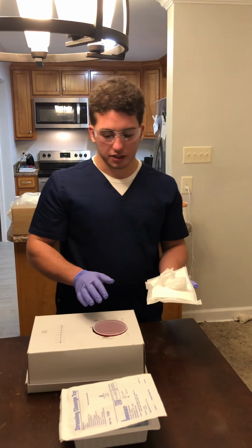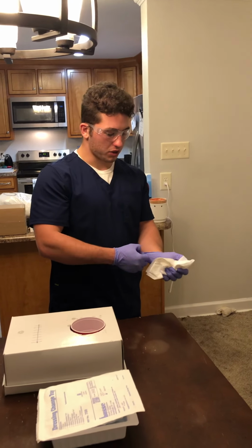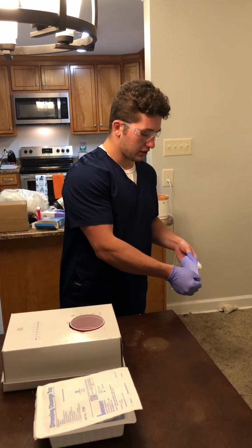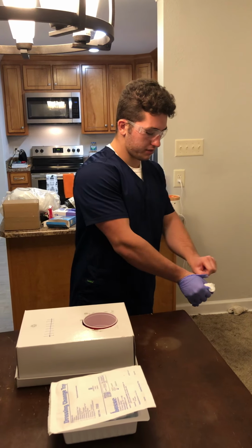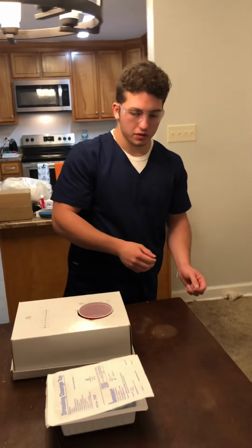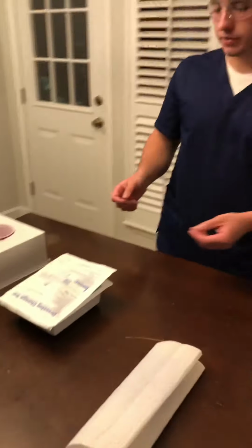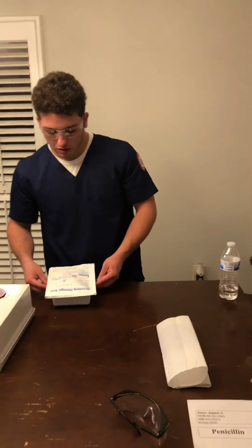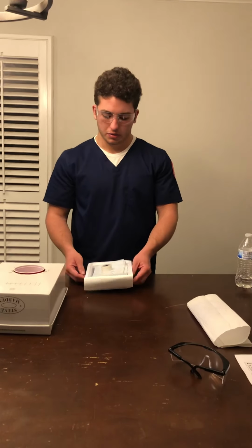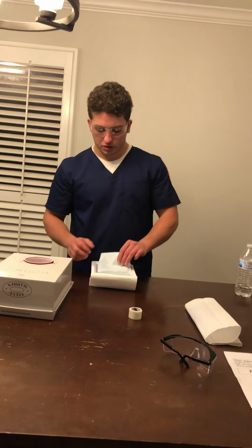Now that none of that has been noted, I'm going to dispose of this, going inside of my glove, going glove to glove, and skin to skin. Okay, now I'm going to prep my sterile field. Alright, I'm going to open my dressing change tray away from my body. I'm going to remove the tape. I'm going to remove the sterile field.